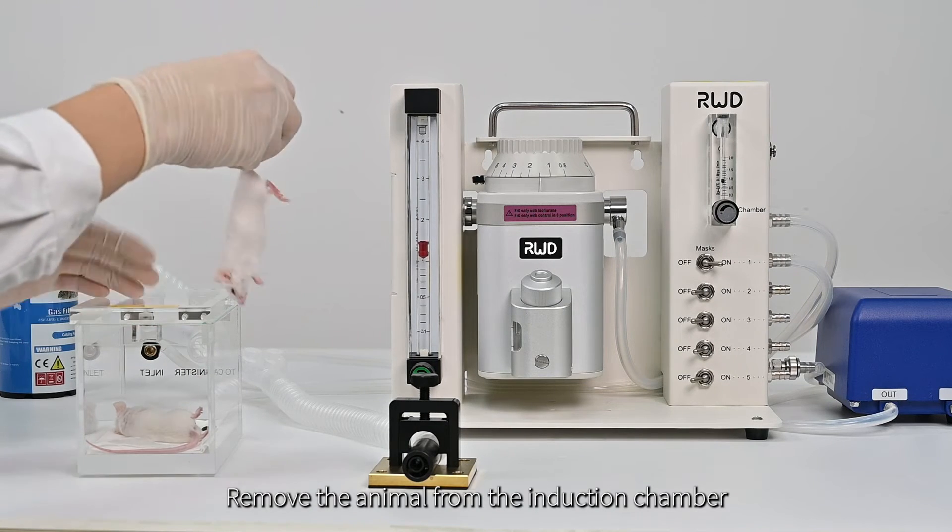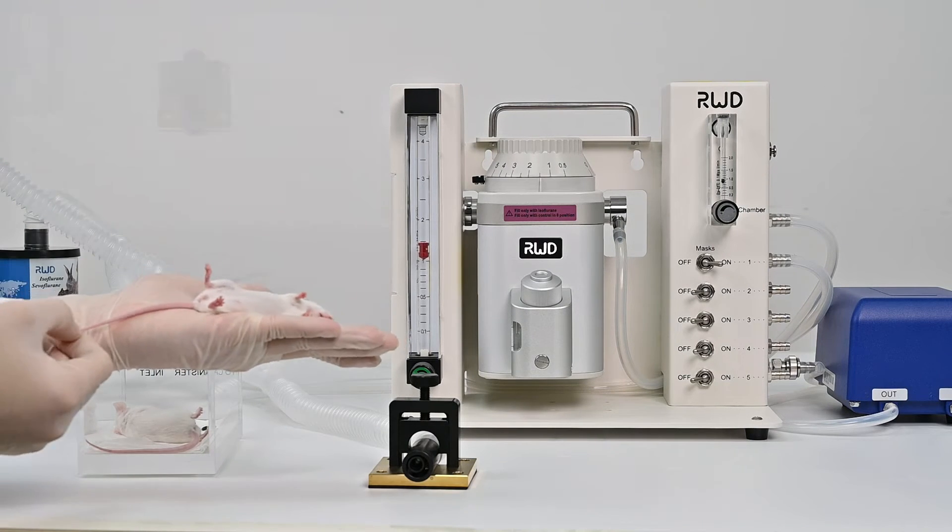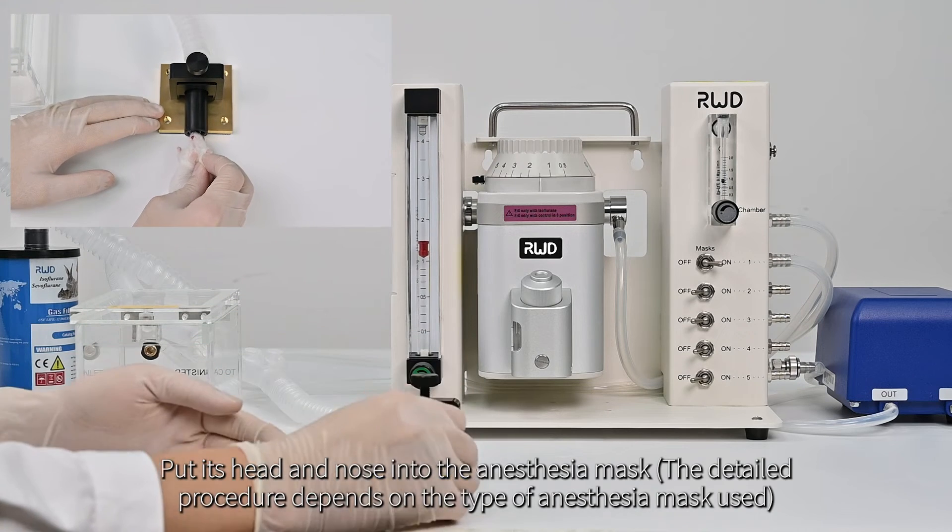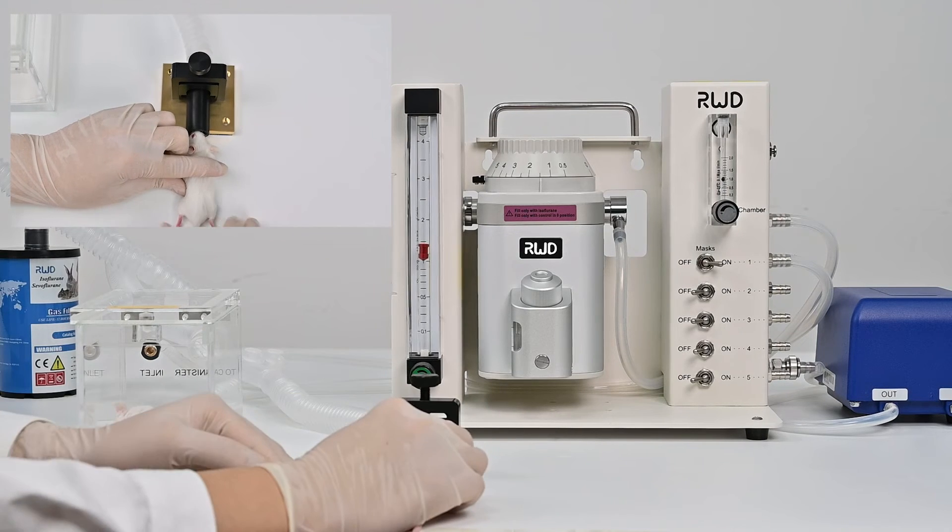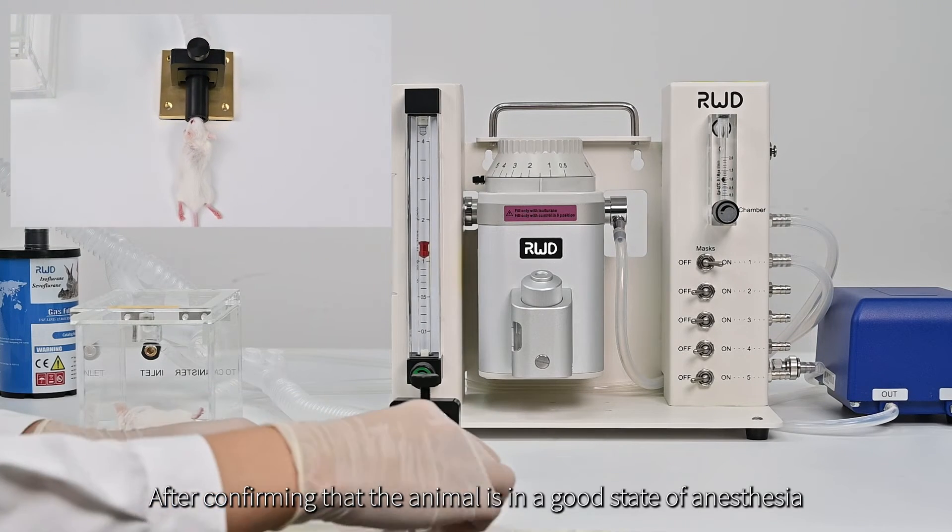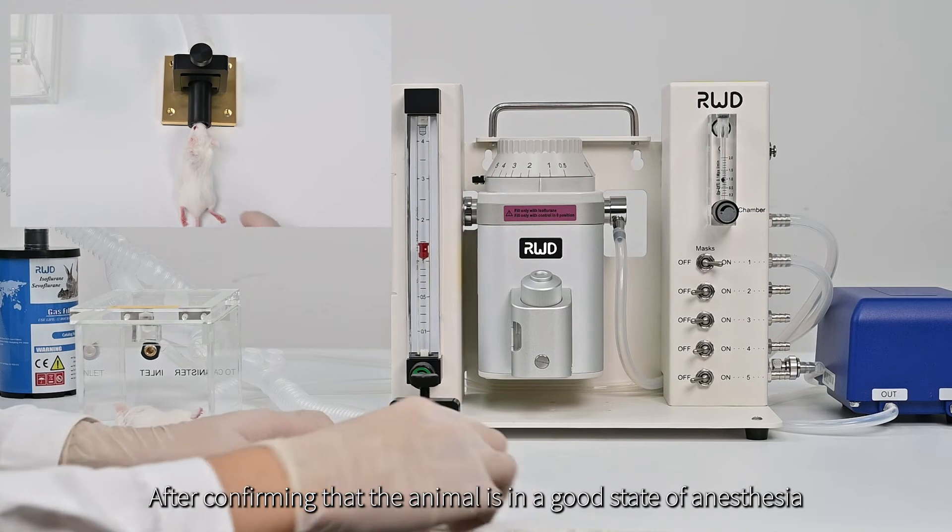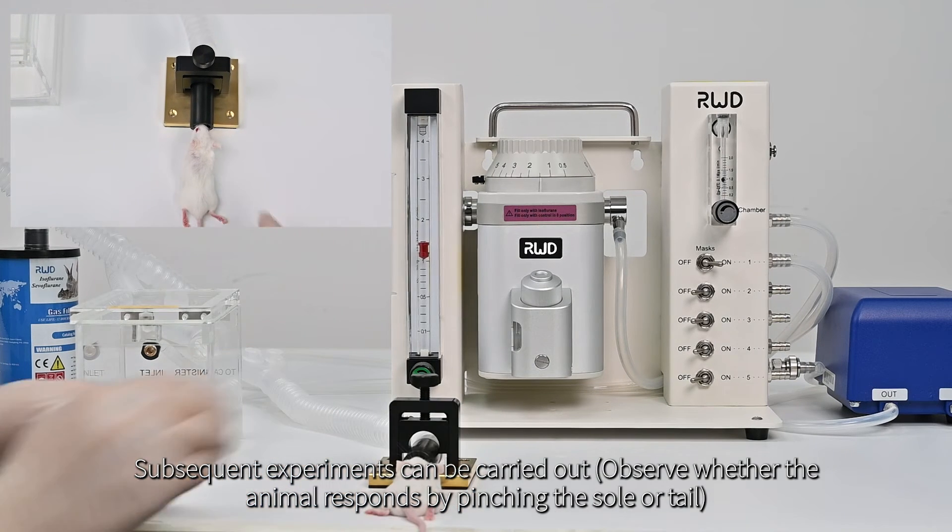Remove the animal from the induction chamber. Put its head and nose in the anesthesia mask. After confirming that the animal is in a good state of anesthesia, subsequent experiments can be carried out.